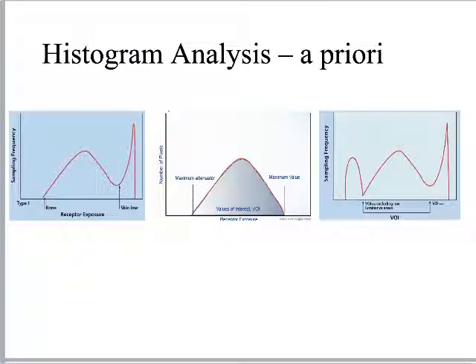So that's what the computer's doing. It's saying, I have this expectation of what a chest x-ray should look like. Anything that doesn't look like what I expect a chest x-ray to look like, I'm getting rid of it. So we call that a priori. A priori means it's just that way. It's something the computer just knows.